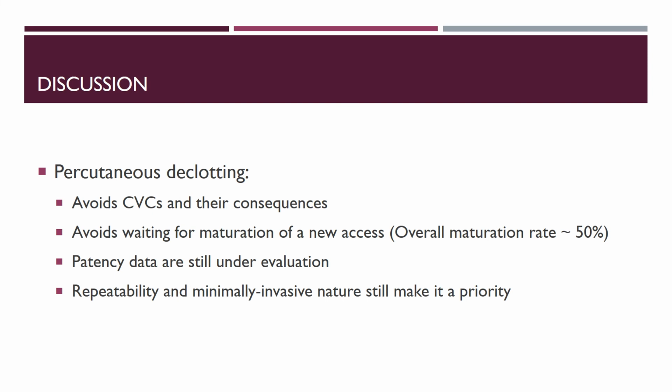Percutaneous declotting also avoids central venous catheters and their consequences. It also avoids waiting for maturation of a new access. Overall maturation rate is approximately 50%. Patency data are still under evaluation. Repeatability and minimally invasive nature still make it a priority.